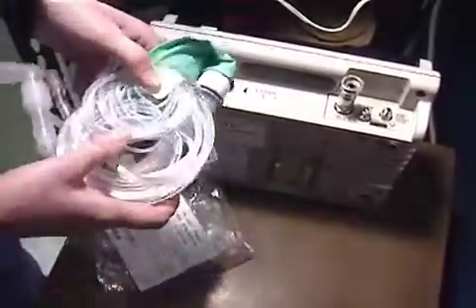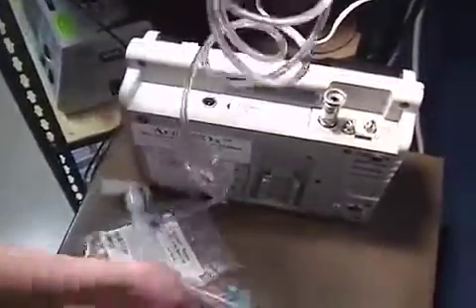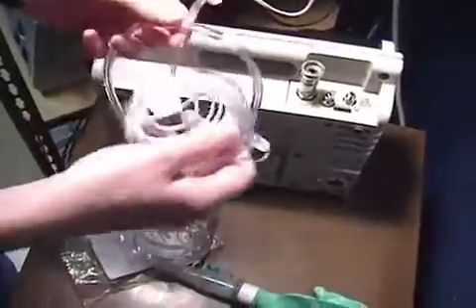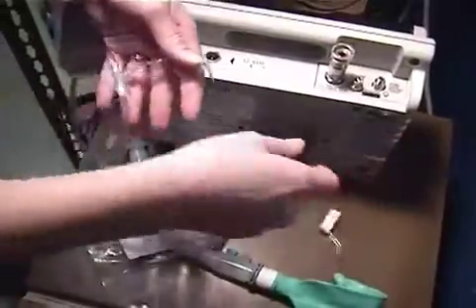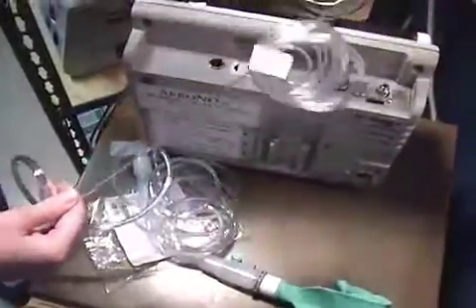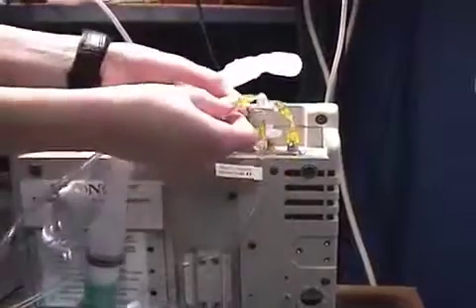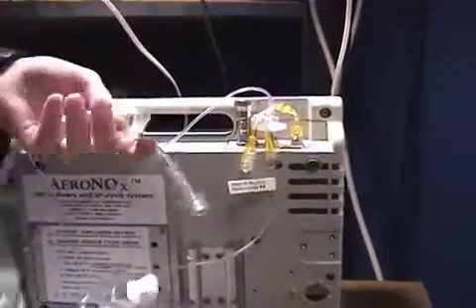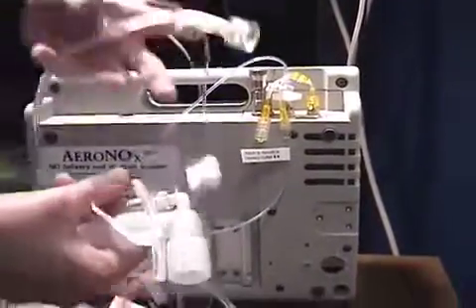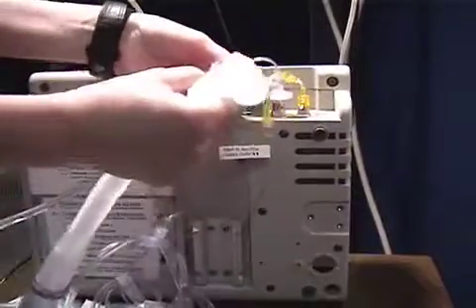The I&O Bagger device is used to deliver nitric in backup situations as well as to bag the patient with nitric when utilizing the Aranox unit. The Bagger device should only be used to deliver 20 parts per million of nitric and the O2 flow must be at 10 liters a minute. Connect the delivery line of the Bagger device to the male port on the bifurcation for delivery.